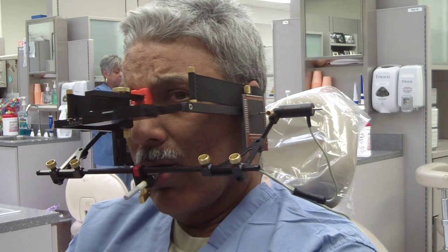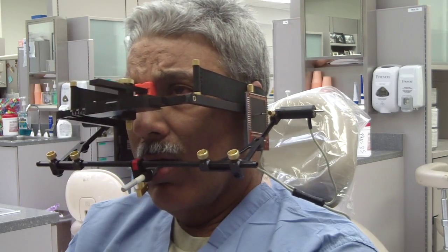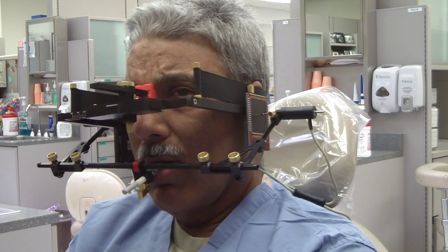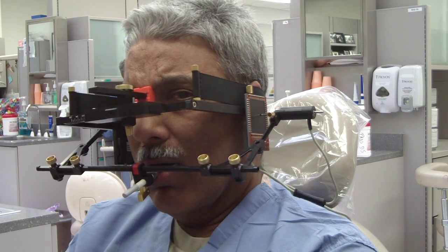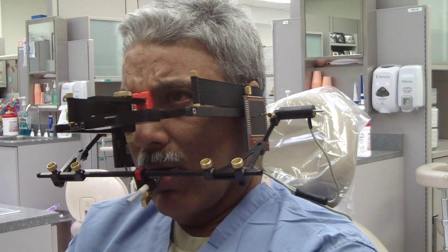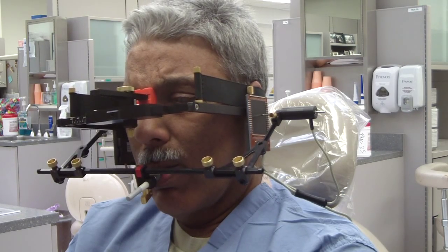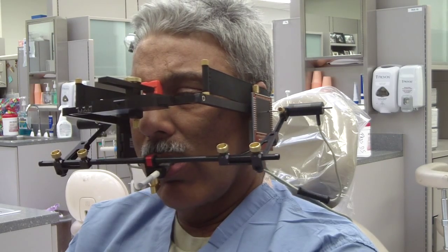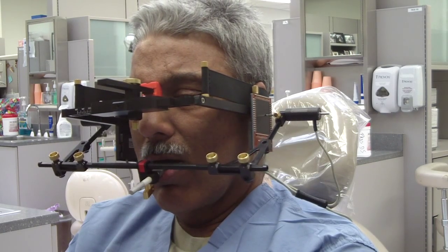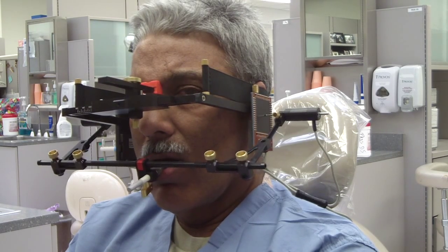It will help to determine whether we need a shorter or longer cusp height. If there is a significant amount of immediate mandibular lateral translation — immediate side shift — then the cusp height should be shallower, shorter, to compensate for that immediate side shift. Otherwise you will spend a lot of time chairside trying to make adjustments to compensate for that.